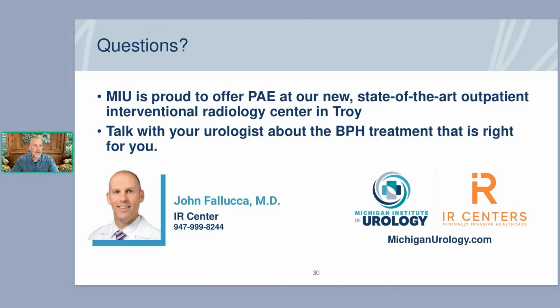Does this process have any effect on the bladder, sphincter, and control? The answer is this procedure is done primarily to shrink the prostate. And so if the issue, if I'm understanding it, bladder, sphincter, and control, is that of continence or incontinence, it certainly can improve that. And it improves that by shrinking the prostate, opening up the channel, the urethra, and allowing you to more completely empty your bladder. And by doing so, it should eliminate the risk of incontinence.